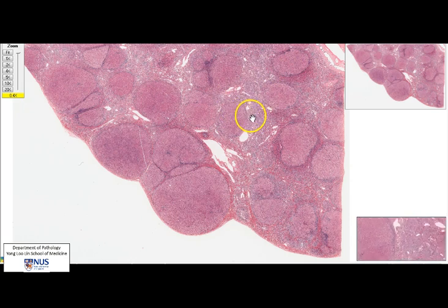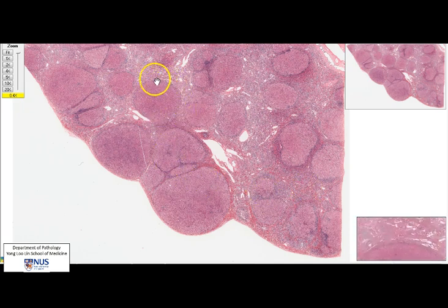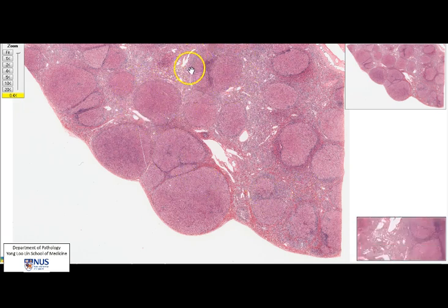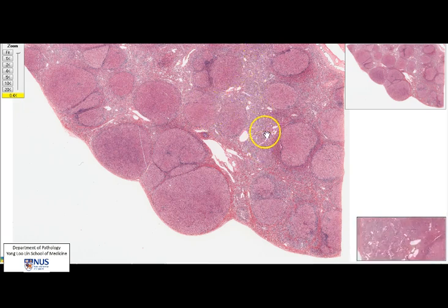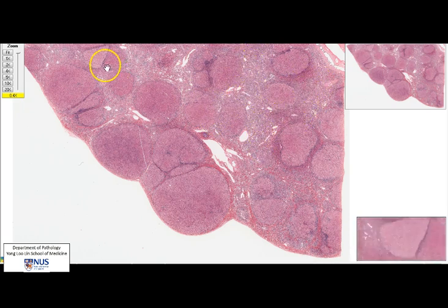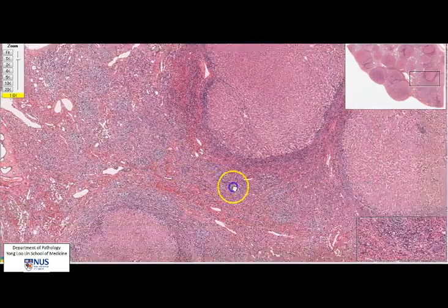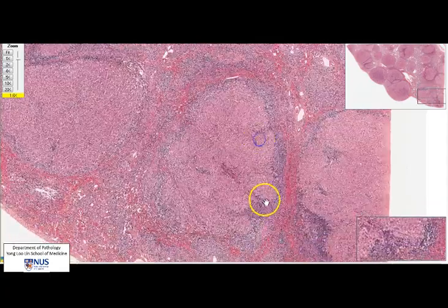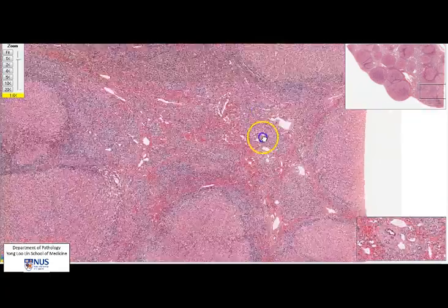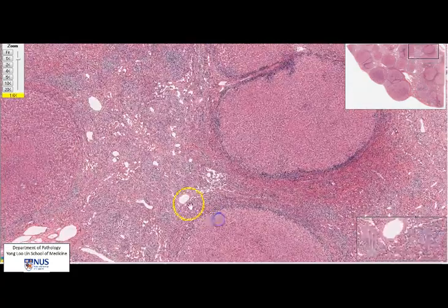Let us define cirrhosis. This is a loss of hepatic architecture due to replacement by regenerative hepatocytic nodules, and these are surrounded by fibrous septa. Looking around, there is no normal liver parenchyma because the entire section has been replaced by nodules.